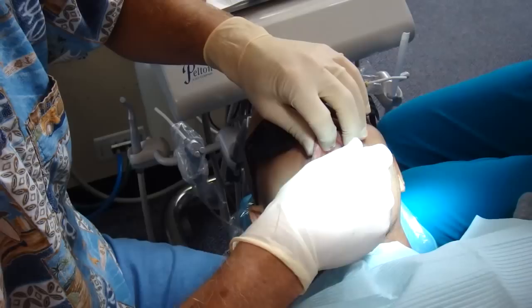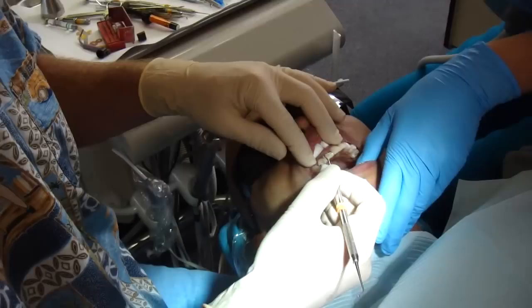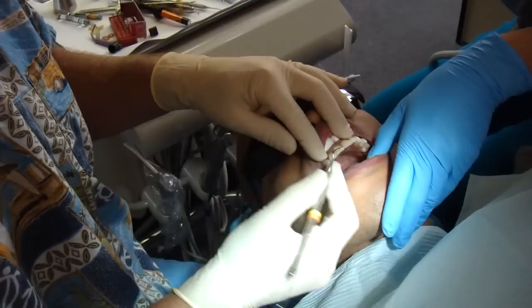Bite together like you just did. Bite hard. Make sure you feel your back teeth come together. Good. Stay just like that. So we're just adding some plastic temporary veneers here and these will last for the two weeks that it takes to make the permanent veneers.